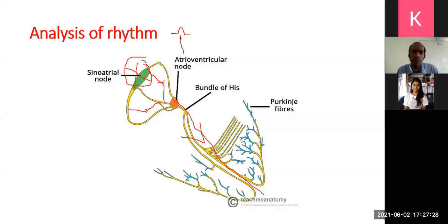Normal depolarization of the atria. Then there is a slight delay, because the current goes through the AV node, and then it starts going down in the normal way in the ventricles. I'm sorry, this drawing is not very good on Zoom, but essentially that's the QRS complex. And then you have a normal T wave. So you have the normal P wave, normal QRS complex, and normal T wave, because the current is starting here.